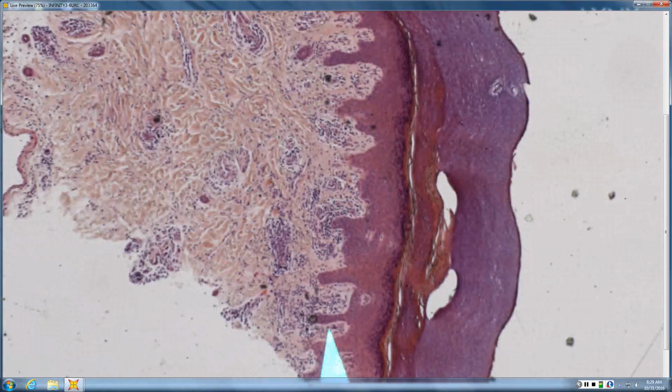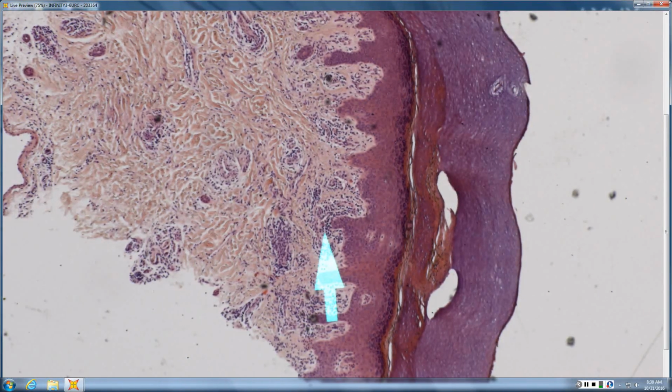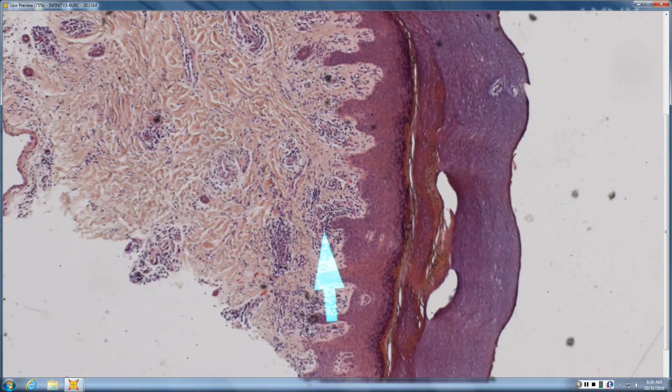We have not so much papillary dermal edema on this one, but you have a perivascular infiltrate, and every lymph sits on a background of white. So when you look at most perivascular lymphoid infiltrates, the lymphs overlap one another, and you see red collagen behind them. Here, every lymph has its own identity and sits on a background of white, like a little black thing on a white background, right? That's the fluffy edema of pernio. So pernio you expect to be acral skin. All the lymphs have their own identity. They're separated. They're on a background of white. That's fluffy edema. That's pernio.